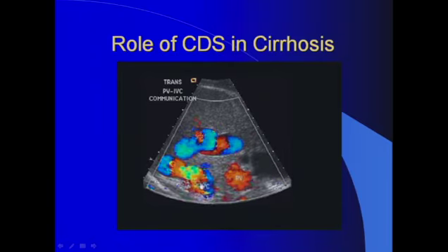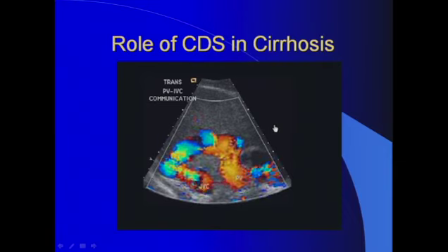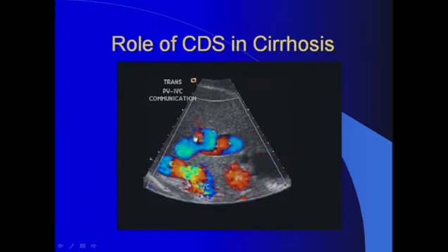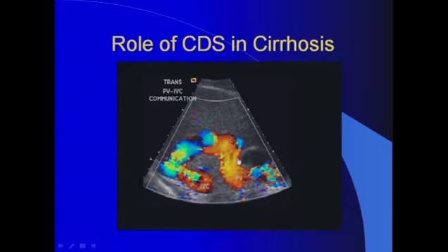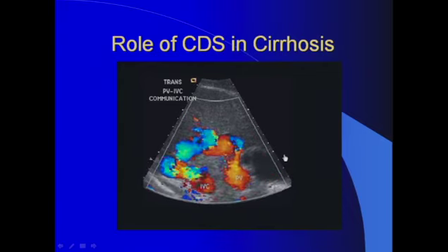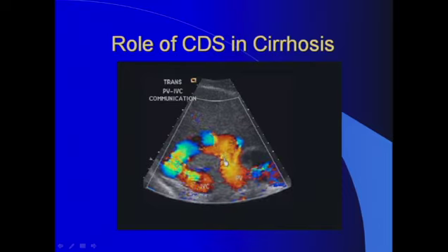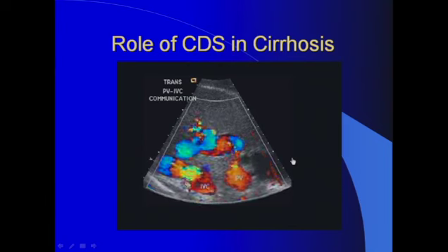So you managed here to avert the need for an interventional radiologist to go and create the shunt, as the patient already has what I call an auto shunt, and there's no need to intervene to decompress the system. It's already spontaneously decompressed. So expect to see these things occasionally in patients with chronic liver disease, portal hypertension, and cirrhosis. Now, if you evaluate this liver just with grayscale without color Doppler, you're definitely going to miss this significant finding in these patients.